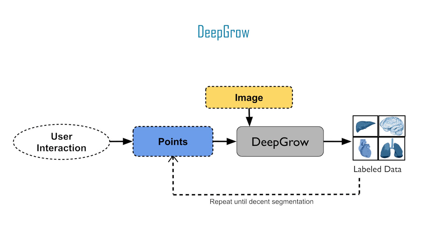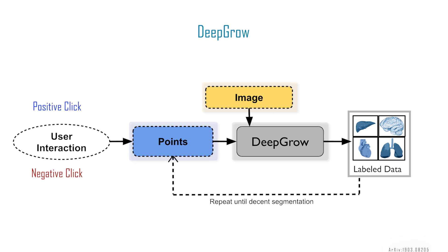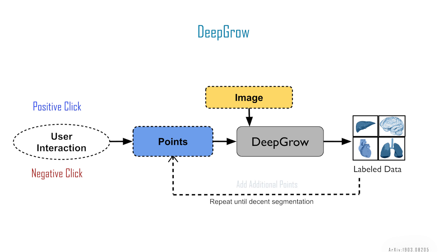DeepGrow is a click-based interactive segmentation model where the user can guide the segmentation with positive and negative clicks. The positive clicks are intended to guide the segmentation toward the region of interest, while the negative clicks are used to guide the model away from over-segmented regions. The points and images are passed into the model, which returns labeled data. If the segmented image needs tuning, the user can continue to add additional points until the segmentation is performing well.